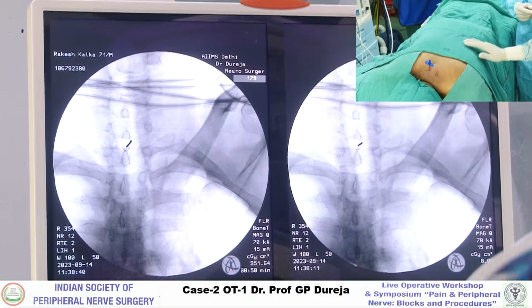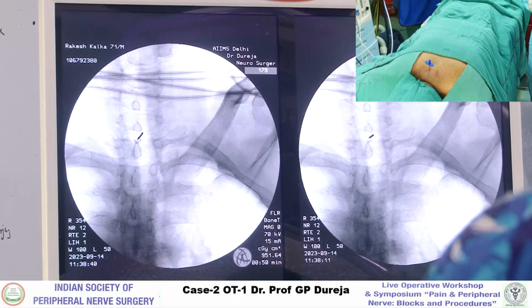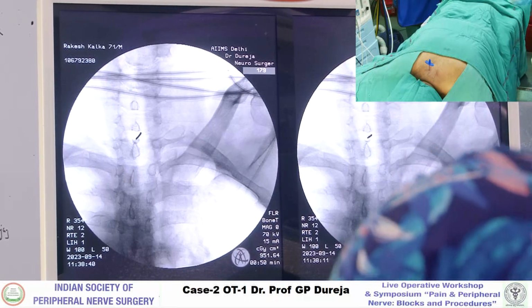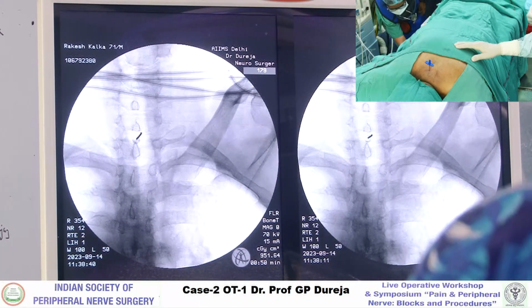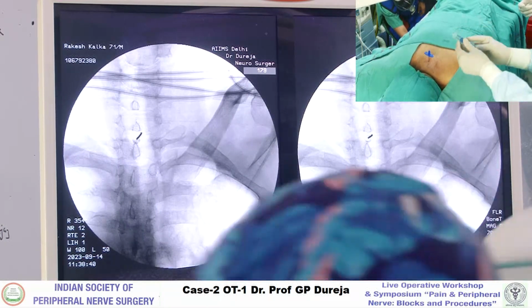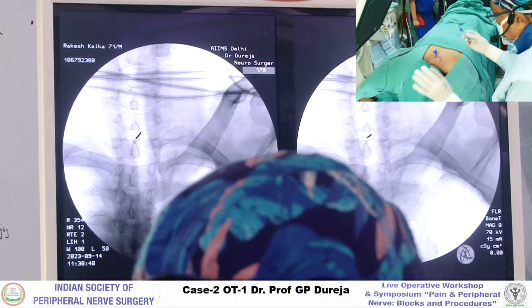So we are in the epidural space on the right side because we want to bathe the right-sided nerve roots starting from C6 to C4. We check it in the lateral position vis-a-vis the position of the needle in the epidural space. The syringe is used for identifying the space. Ligamentum flavum is the feel which you have to have.